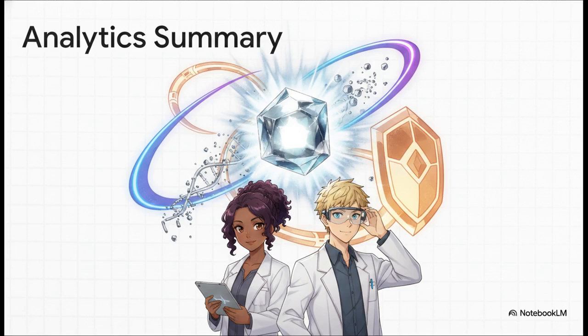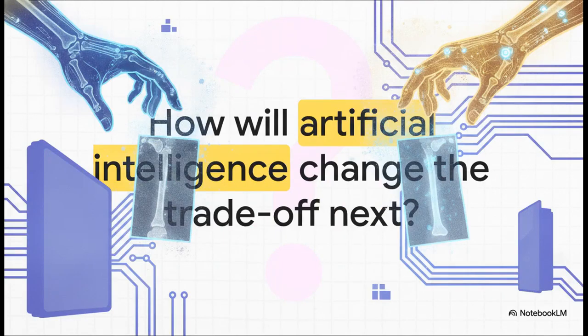system intact. So as we close out today's explainer, I want to leave you with a thought. The medium has completely evolved. We've traded darkrooms for digital pixels, but the underlying physics problem, it hasn't changed. A larger digital detector element today does exactly what a larger silver halide crystal did back then. It captures signal faster but lower spatial resolution.